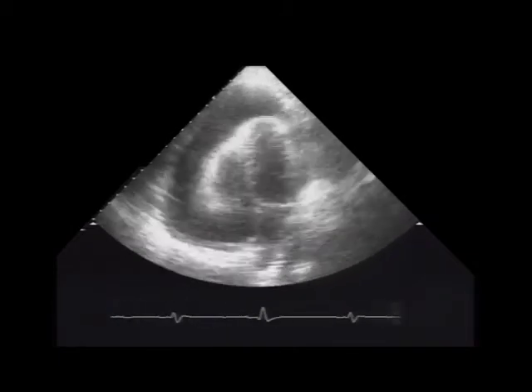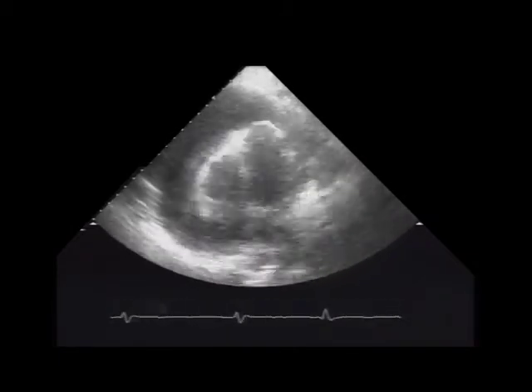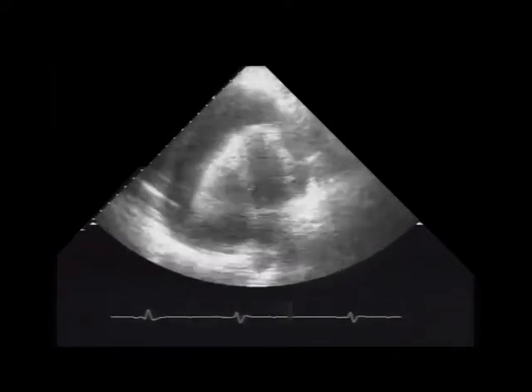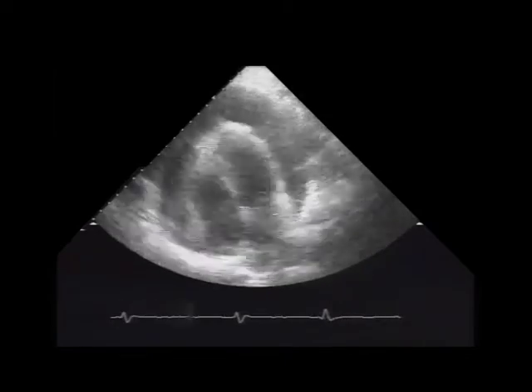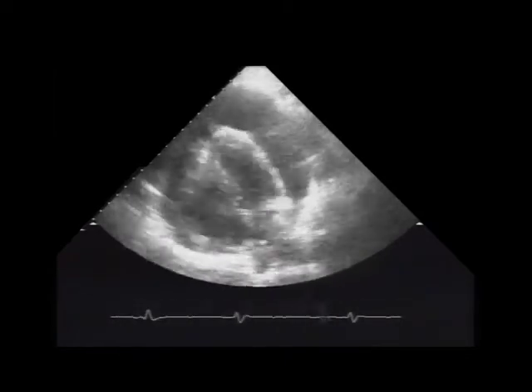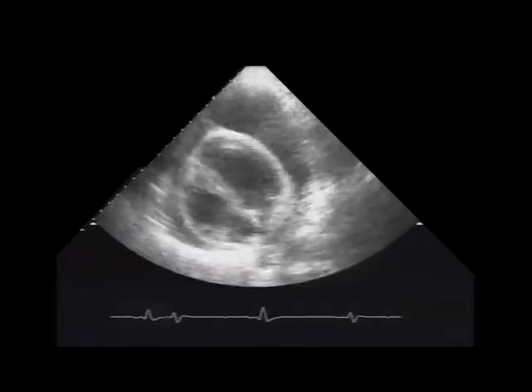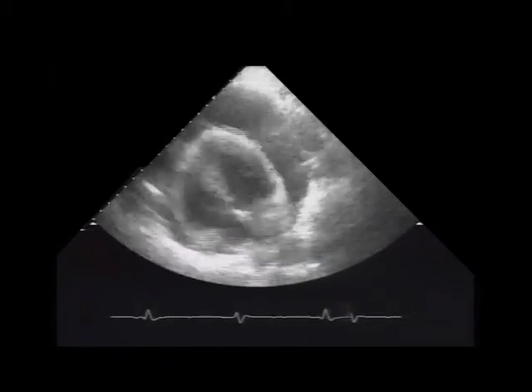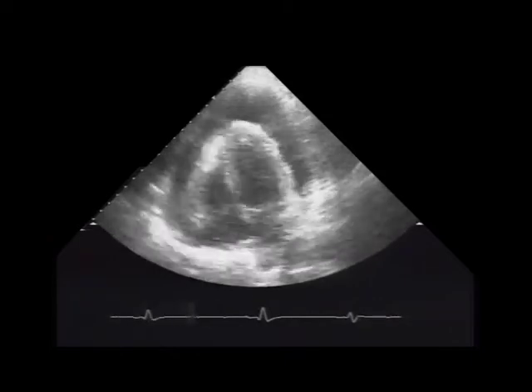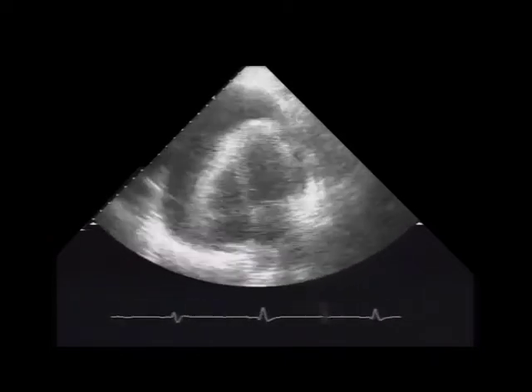And on a chest x-ray, it's impossible to differentiate between a big pericardial effusion and just cardiomegaly. They look really the same. You just see a large cardiac silhouette. So really we can't rely on ECG findings or chest x-ray to make this diagnosis. It's all about the ultrasound here.